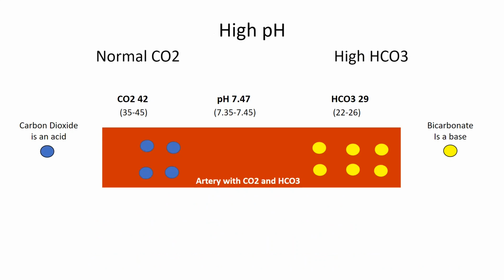One more scenario, and you probably guessed it, it's metabolic alkalosis. You can see there's way more bicarb than CO2, so this is clearly alkalosis. But please pull out slide 3, the basic ABG evaluation steps, one more time and follow along with determining the cause.